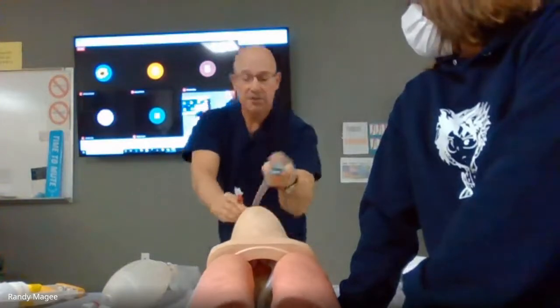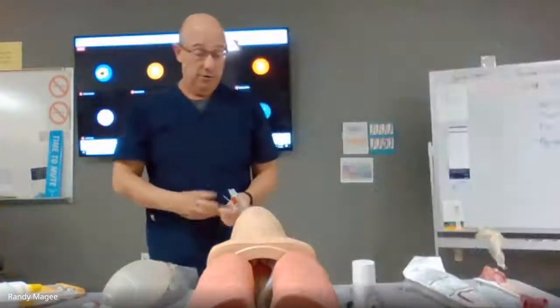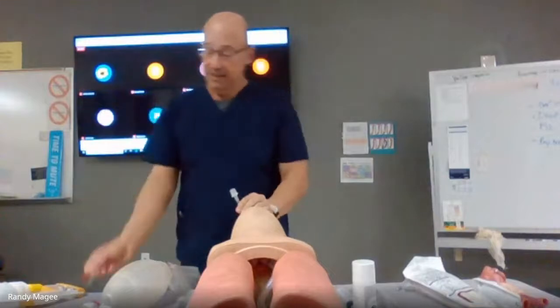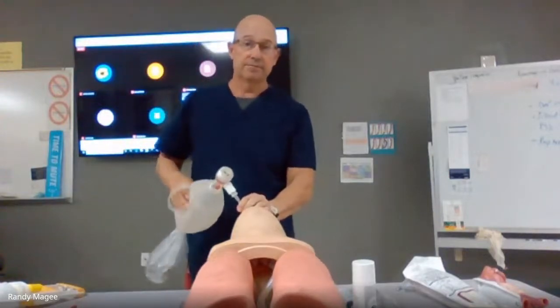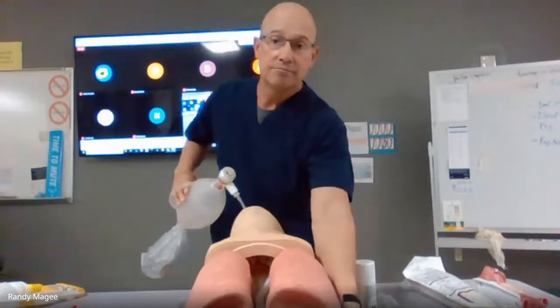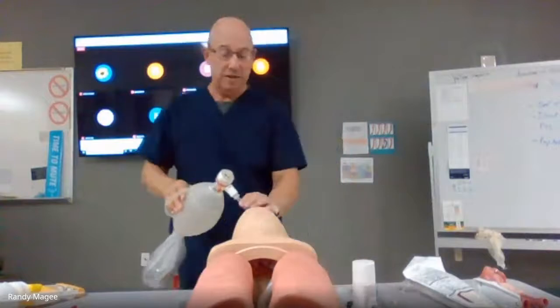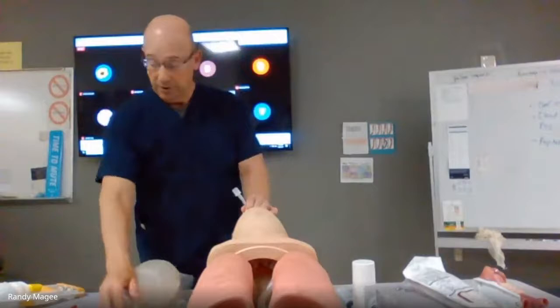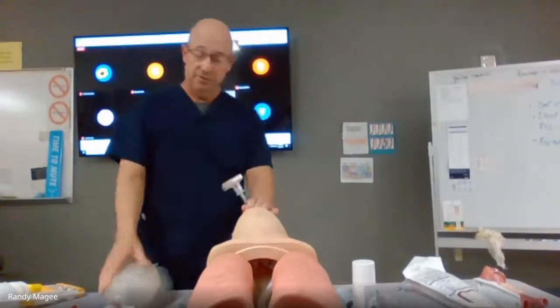I pass the tube. I watch it go through the vocal cords. I air up the cuff. Remove the stylet. Then I want to start my confirming process. I'm having someone hold the stylet. So I'm going to put my stat cap on.